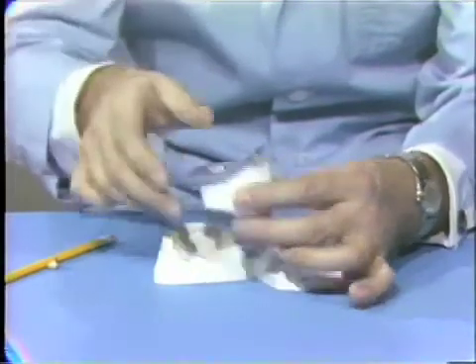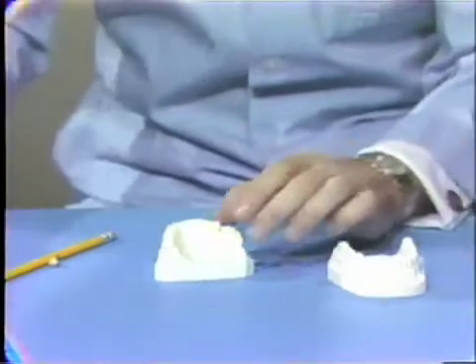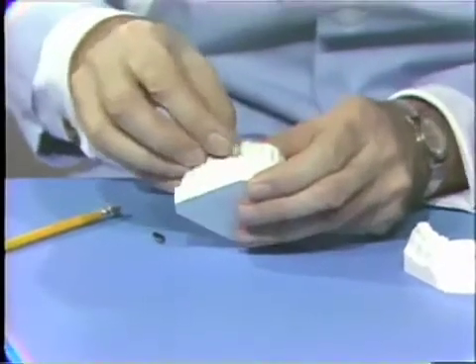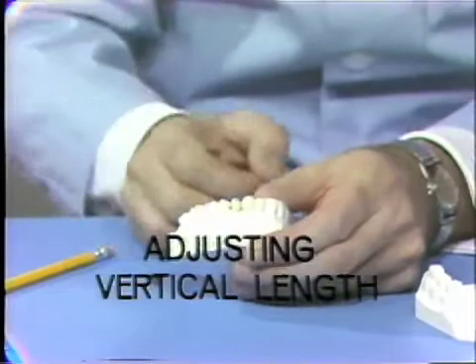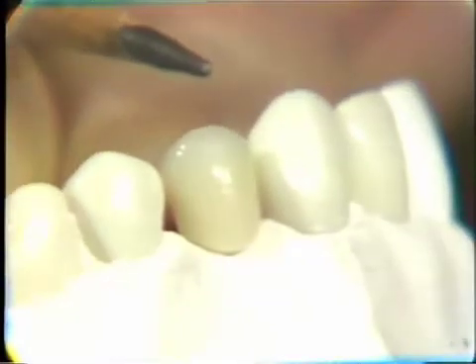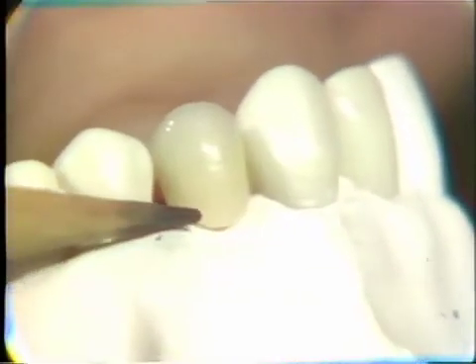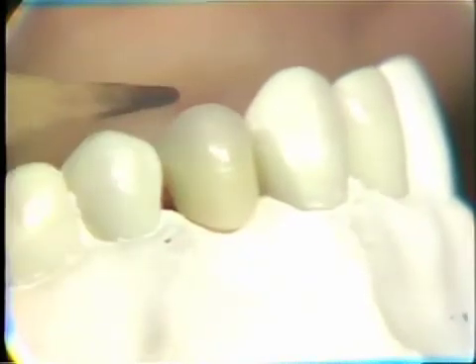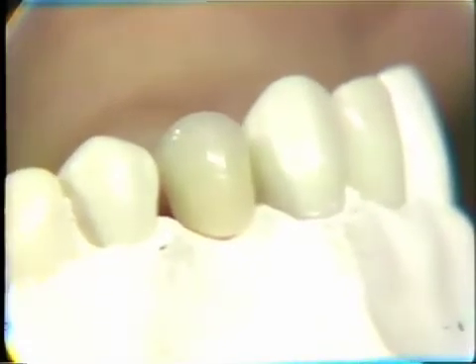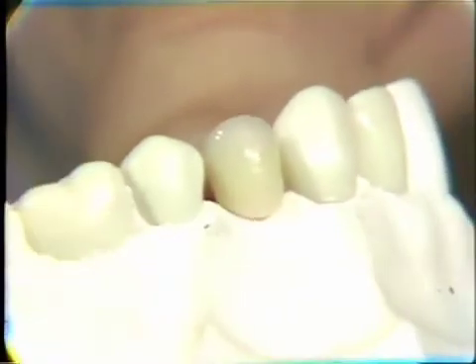Now, the first of those is adapting it for the correct vertical length. So let's go back to the model itself and take our facing and put it into position on that model like that. I think you can see that in its present length, this tooth is already about the same length as the teeth on either side, and we've got to trim it down on the gingival surface so it'll seat down and allow room up here for the metal backing and the occlusal surface that has to be adapted on there. So we've got quite a lot of grinding to do on this surface in order to get it down and adapted to the mucosa.